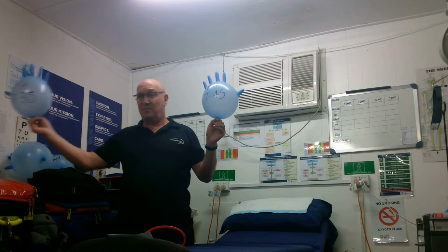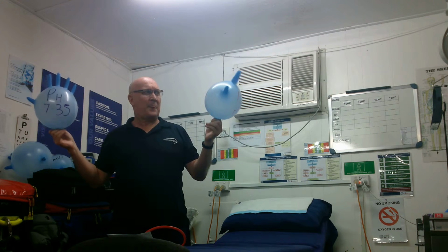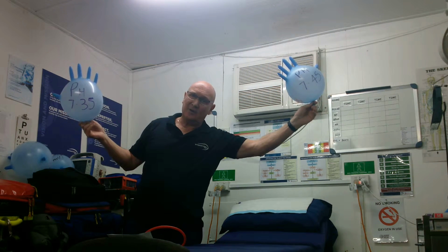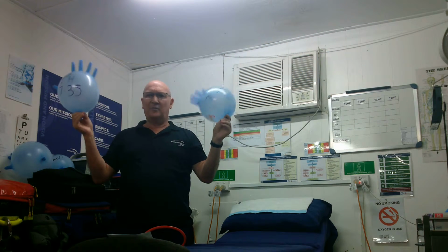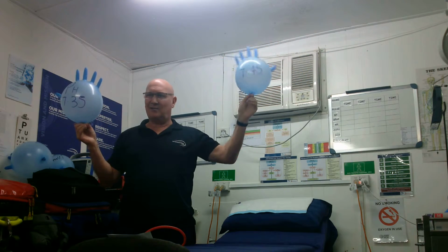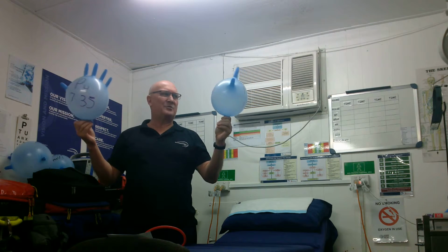So if I was to go that way to the right, then I'd be more acidotic. Or if I was going that way to the left, increase in pH, more alkalotic. So that's important. Then we determine whether the patient is alkalotic or acidotic. Well, very easy to do. Straight away we look at our results.